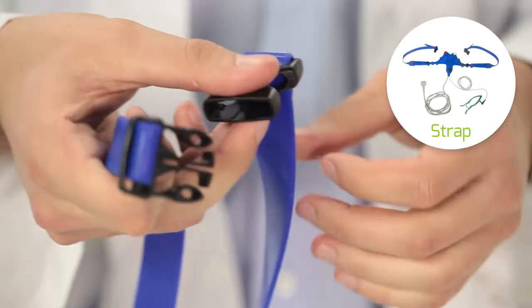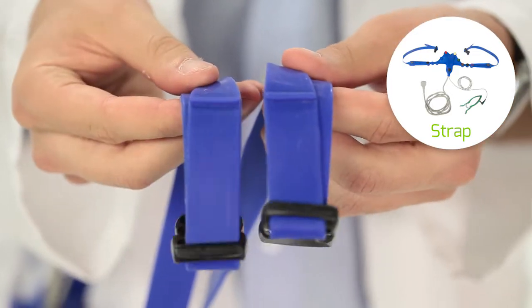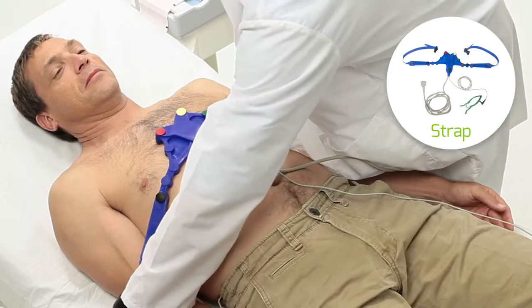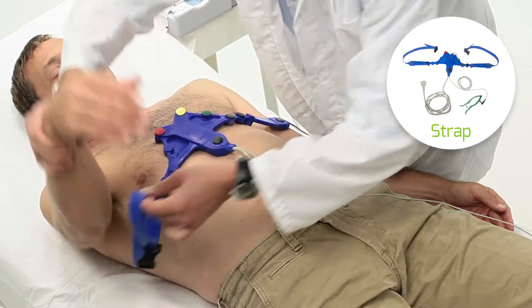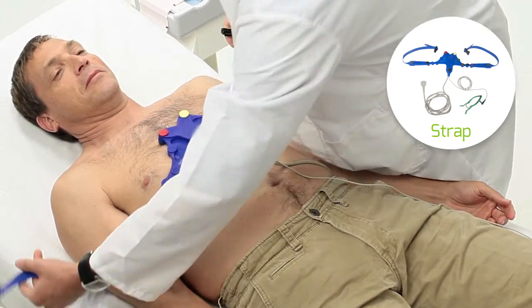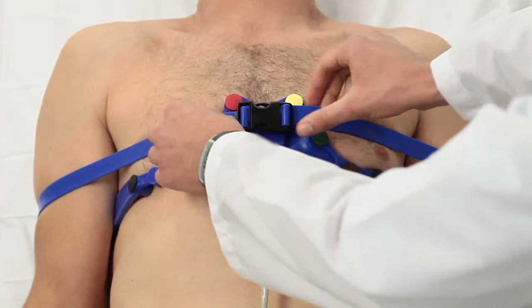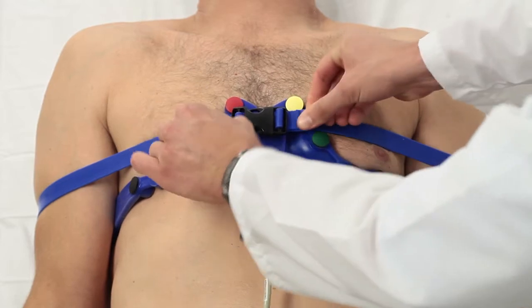If you are using the strap belt, adjust the buckle flaps in a symmetrical way. Place the straps beneath the patient's mid-arms between elbow and shoulder and then over the arms. Buckle the belt over V1 and V2 to improve electrode body contact. Make further adjustments to the straps if needed.